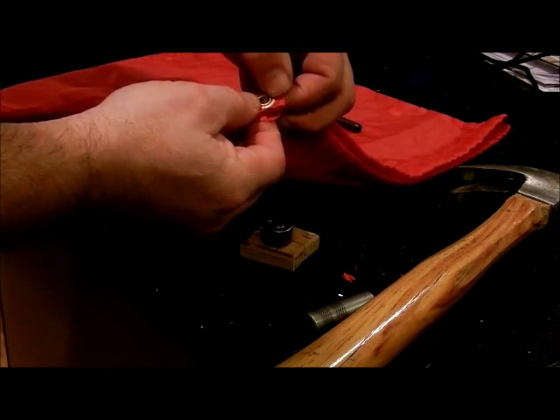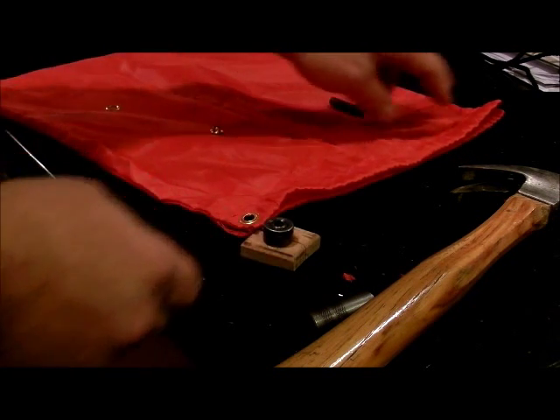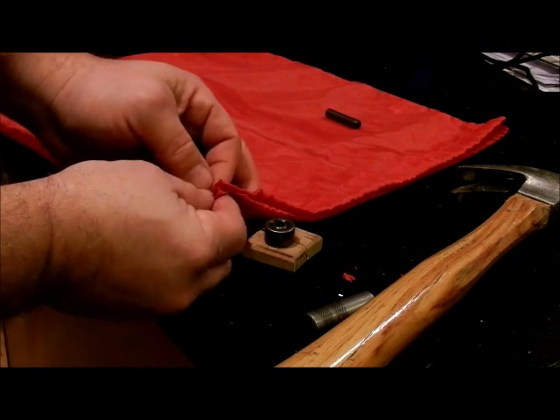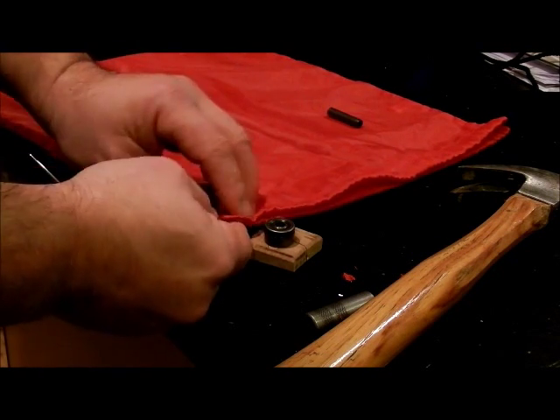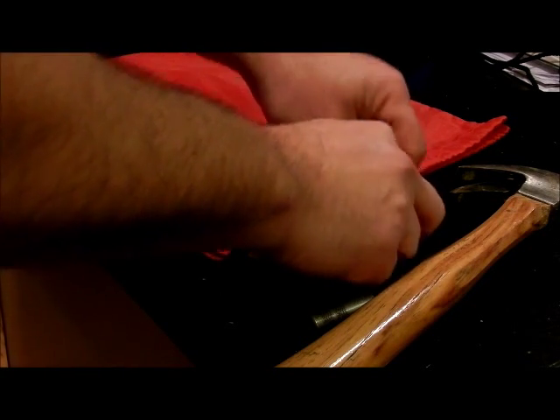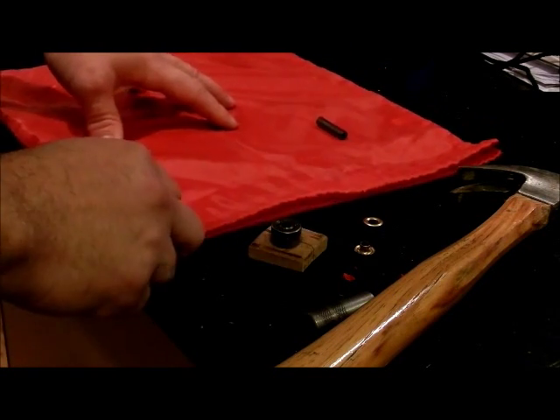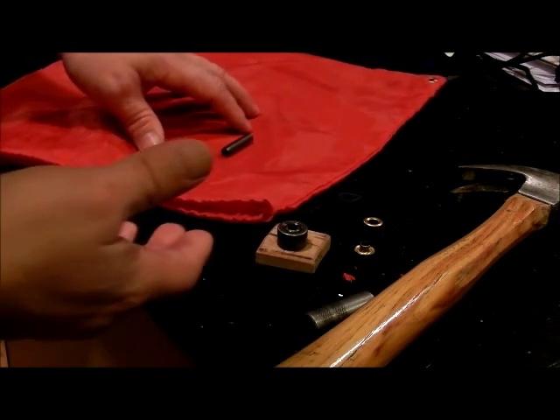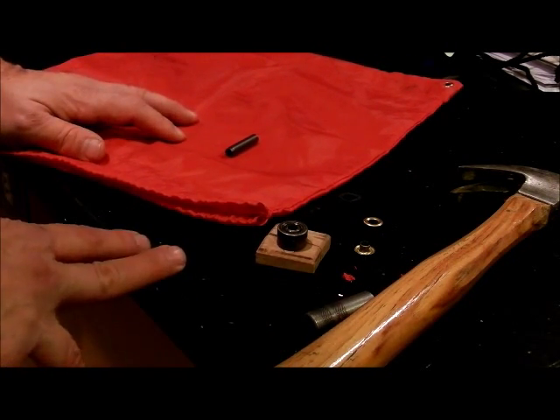Not too shabby. Alright, I'm just going to do the same thing to the other side. Hopefully it shows you how to put a grommet on something. It's not perfectly even, but you know, if it was perfect, then I'd be a manufacturer someplace selling a million of these things. You can get something similar to this for about $30 on eBay. But you know what? Why do that when you can make it at home and it works just as good, or perhaps better?